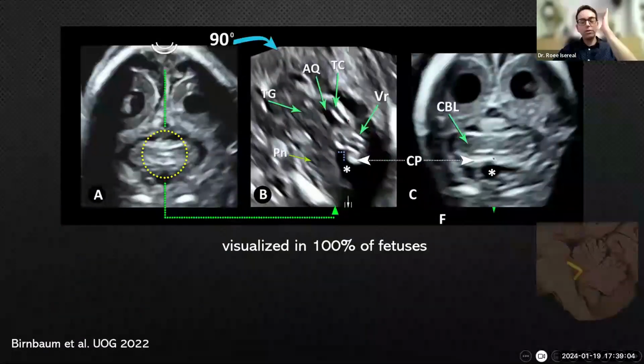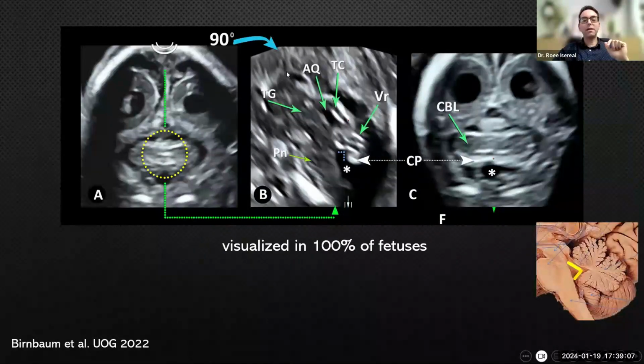Now, when we go to the classic mid-sagittal view of the brainstem, midbrain, and hindbrain, at, let's say, 15 weeks here, clearly we can see in the midbrain the aqueduct, as I mentioned, the tectal plate, which is thinner dorsally, sorry, and ventrally is the tegmental plate. When you go a little bit lower, this is the normal protrusion of the pons. Behind the pons is the fourth ventricle, and then you can clearly see the vermis with its tiny reflections, which represent the early vermian fissures, as I showed you before.